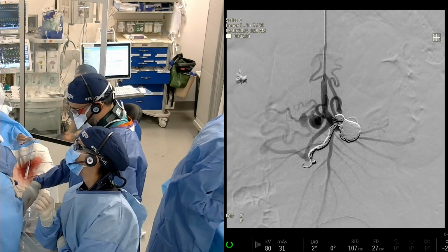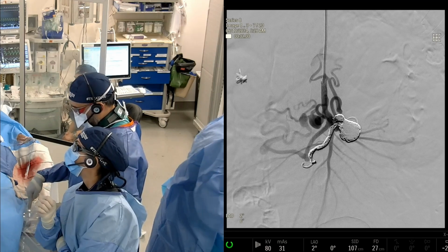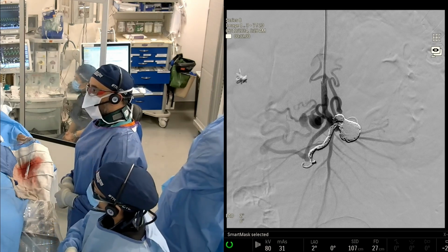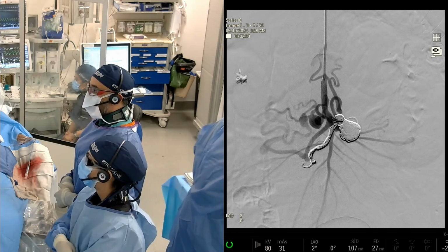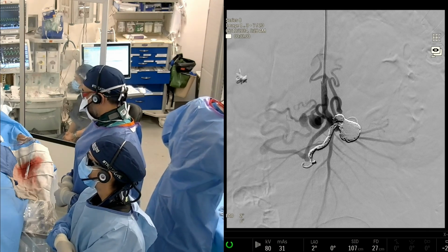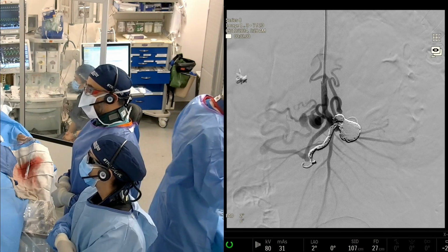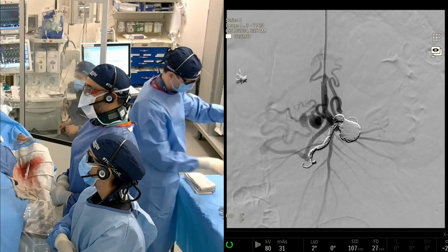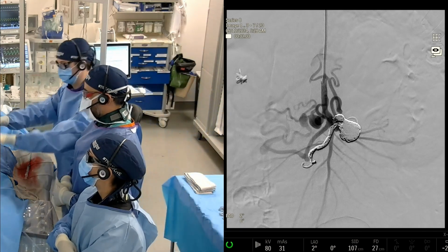One thing I want to mention, based on what Gary was saying about putting liquids in after you've occluded the outflow: you do have to be really conscious of the fact that the outflow is occluded, because some of these liquids, in particular Obsidio, can go through the coil mass, and we've seen that a couple times where it can actually shear a little bit in the coils and go distally. It's hard to see fluoroscopically to even know you're doing that.